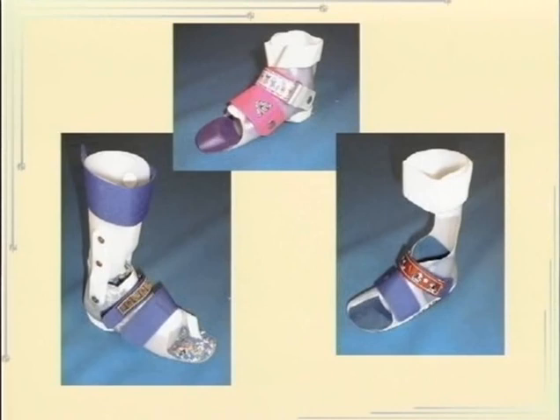And this one over here has a joint built into the ankle, so this would be more of a DAFO that you would use if you had range of motion, so you could bend your ankle in past neutral in the dorsiflexion range, but you'd want to block it so that your toes aren't going to go down, and you end up being stuck walking on your toes.